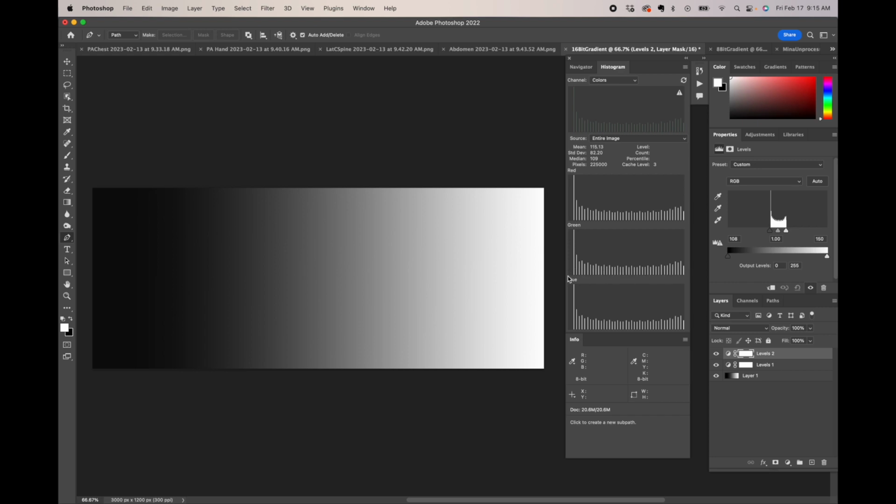This combing represents the data that was lost, or all the shades of gray that I basically just threw out because I crunched them together, so this area that was formerly a middle gray is now the outright white point.